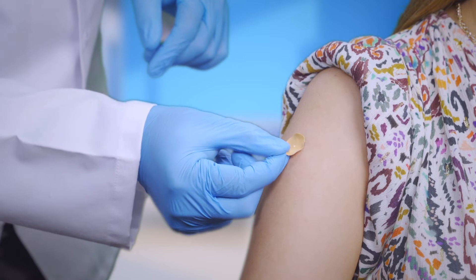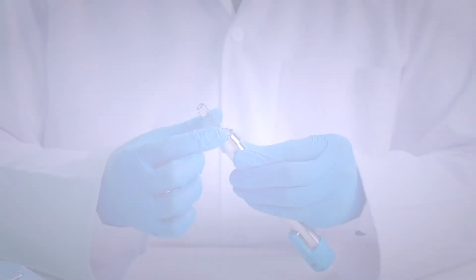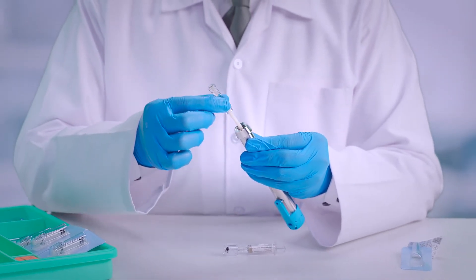Apply an adhesive bandage at the injection site. Twist the cartridge counterclockwise and discard the disposables appropriately.